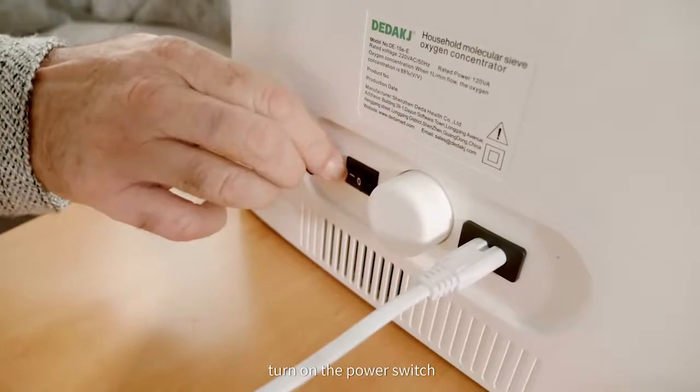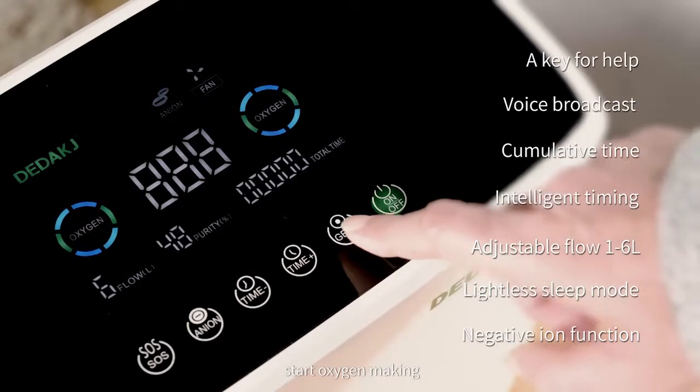Wear the oxygen absorber correctly. Turn on the power switch and press the ON key to start oxygen making.